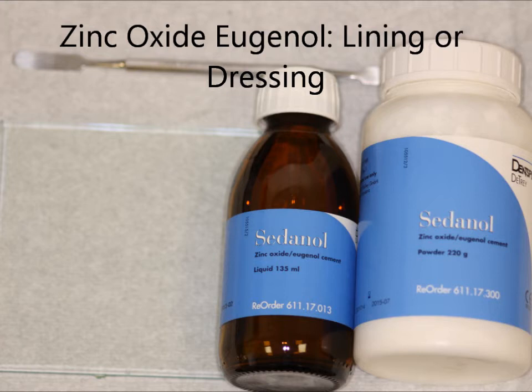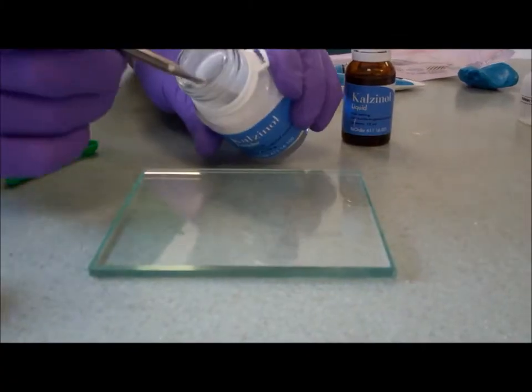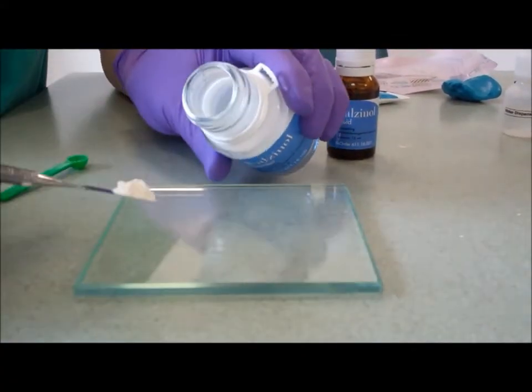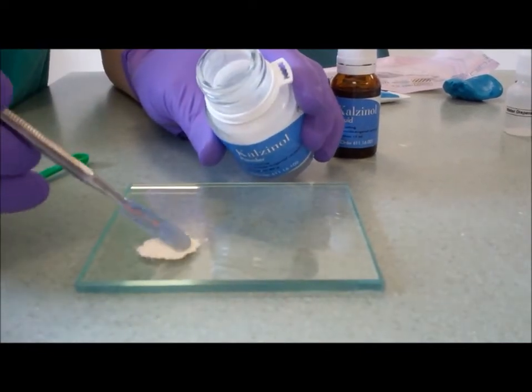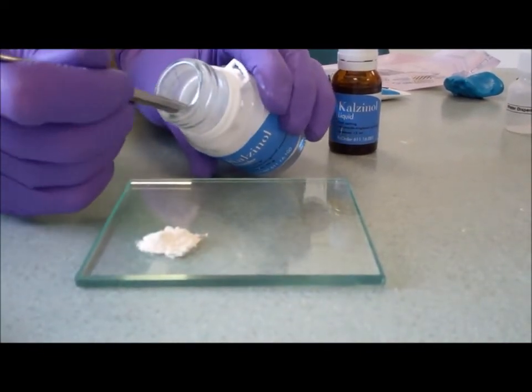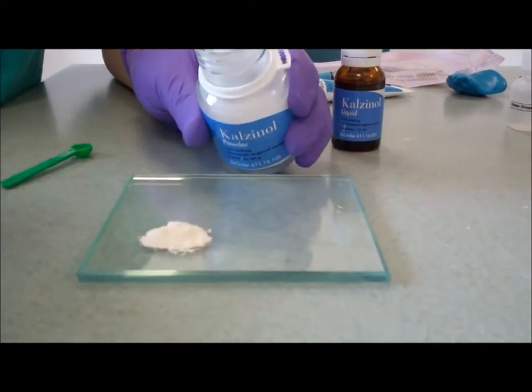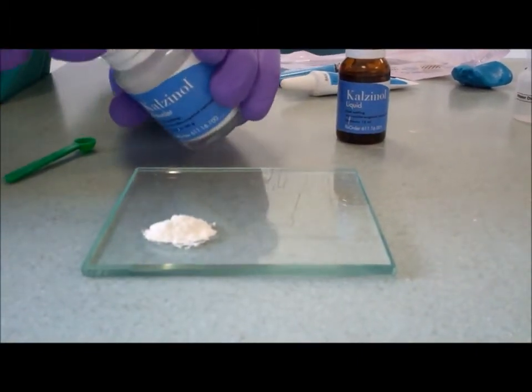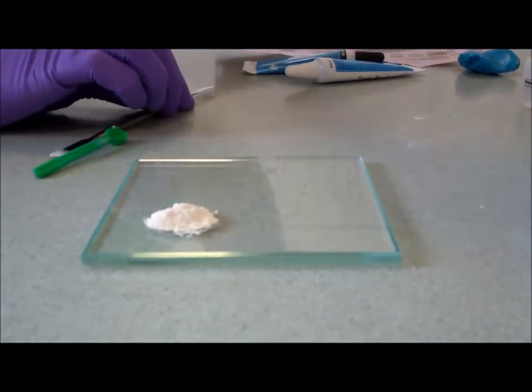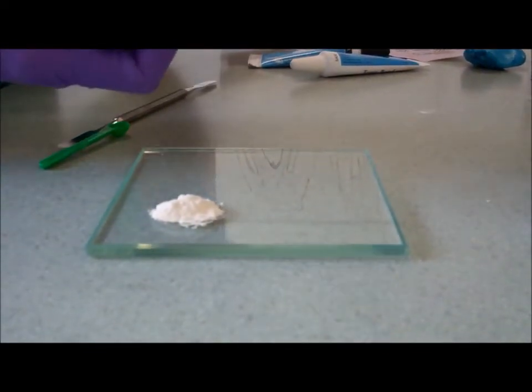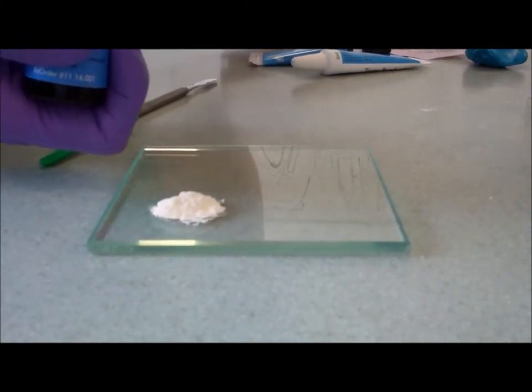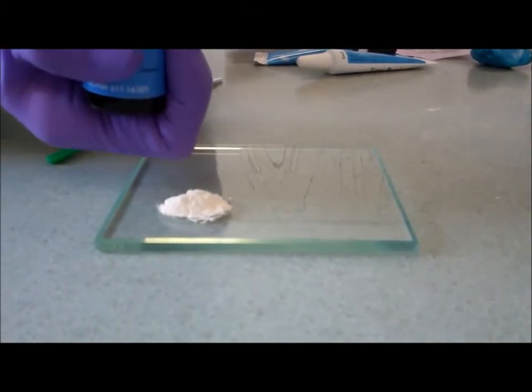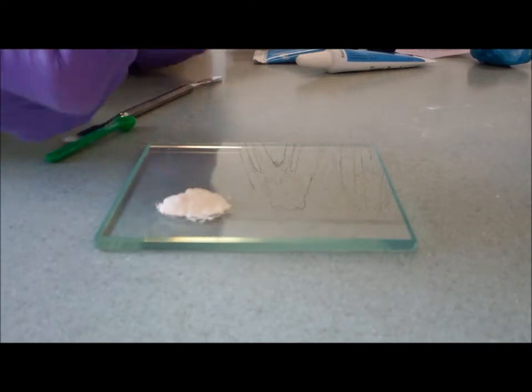Zinc oxide eugenol cement can be used as a dressing or a lining, again in similar consistencies. So put out a suitable amount of the powder. Now the end amount of material that you're left with is really dictated by the liquid with zinc oxide eugenol, and you often need more than you think. Also it's not a plastic bottle, it's a glass bottle.